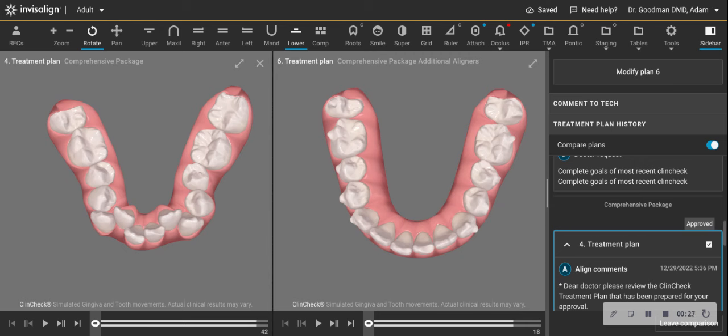extract. Invisalign some 24 years ago introduced this concept of the ClinCheck, where you would move teeth on a computer in order to make the aligners. But really, what it also provides is great value in terms of being able to visualize how your teeth will look so that you make the right decision in treatment.